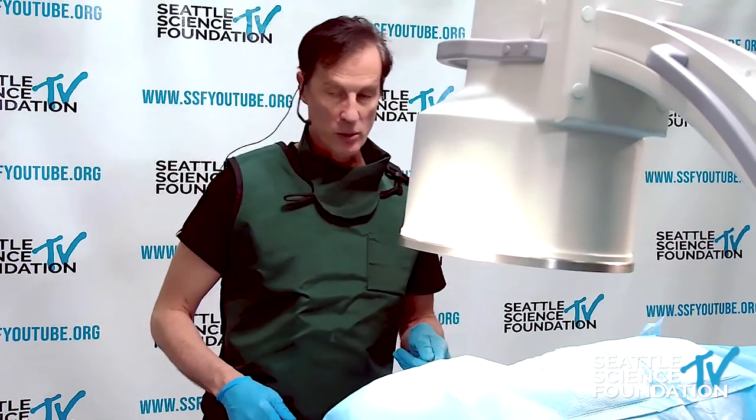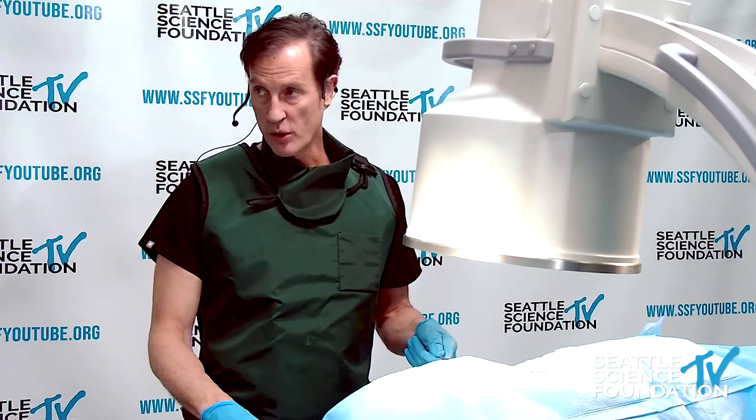We'll do most of this from the lateral approach. We did 4.5 previously, so I'll focus on 3.4.